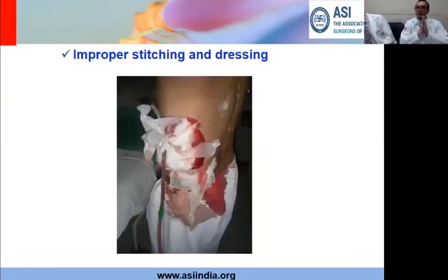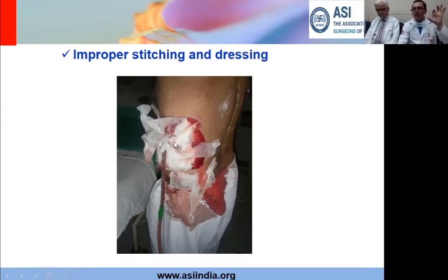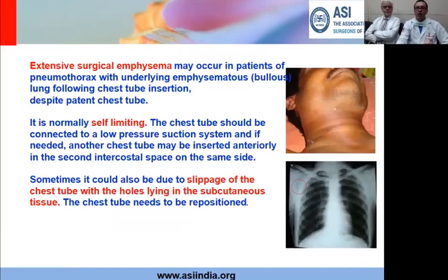Now as I was saying, it's important to put a proper purse string suture. See what happens if the purse string suture is not done properly. This is an image from one of my own patients, chest tube put by one of my team members. The purse string suture was loose, so there was some blood seeping around the chest tube. They informed the sister, who put more dressing, but the dressing is not the answer. Dressing will not control it. It will only conceal it. The answer is to remove all this dressing, clean it, and then put a proper purse string. So unless you have a proper snugly fitting purse string, peritubal leakage can always be a problem.